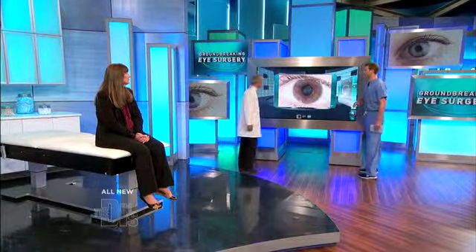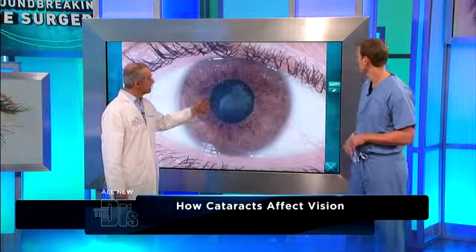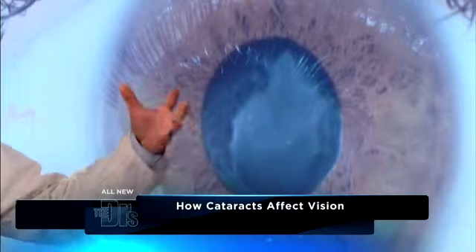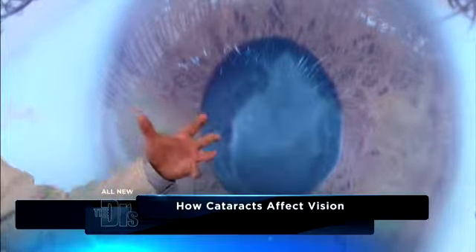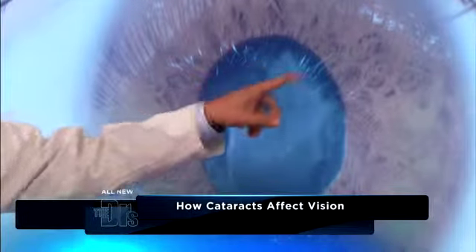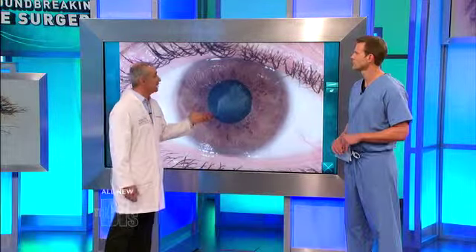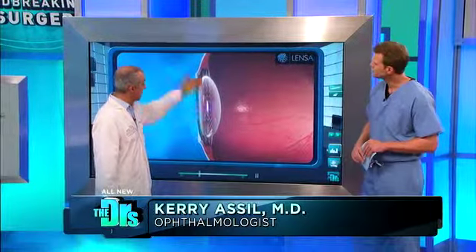Cataracts are very common throughout the world. This is an actual cataract in the patient's eye. What a cataract is, is the loss of transparency of the natural lens inside the eye that's meant to focus everything. And it becomes like a dirty windshield. Literally here you can see the opacity, and as this gets worse and worse, people can literally become blind from this.